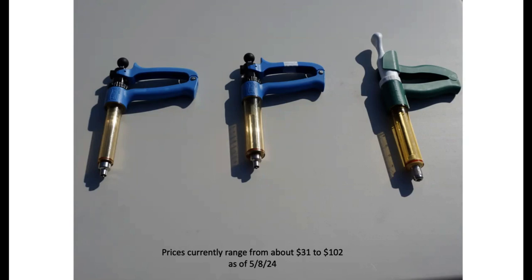If you're doing a 5 cc, then that 50 cc barrel comes in more handy because it'll adjust from 1, 2, 3, 4, or 5 cc's. Now you may say, well, I could get the 50 cc barrel and set it on 2 and give a 2 cc injection. And you can. The challenge with that is when you think about if you have it set on 5 and you squeeze it, you have a full squeeze or a full trigger pull there. When you set it on 2, it's much shorter, and sometimes you're a little unsure if you actually have given that injection or not. So when I'm deciding which barrel size I want to use, I'm going to base it off the amount of vaccine I need to give. So if I'm giving a 2 cc dose of vaccine, I'm going to use a 25 cc barrel.